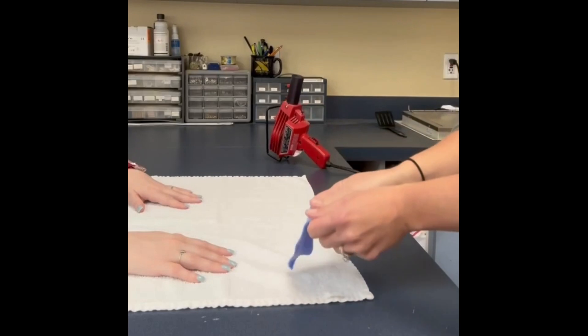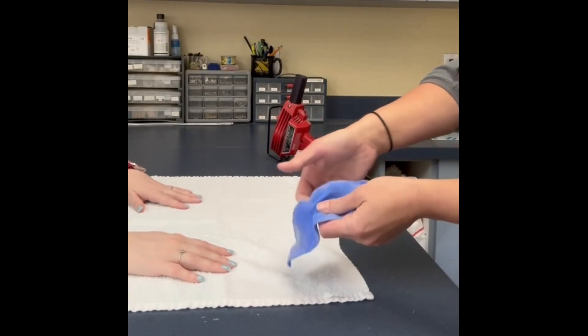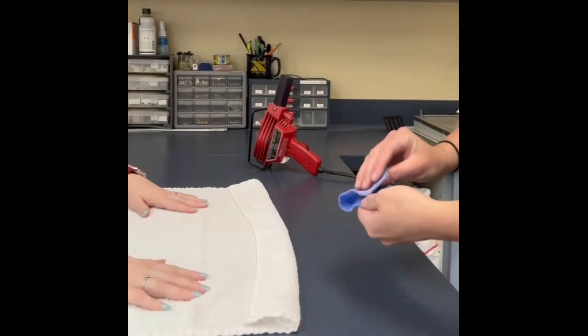Pull the material perpendicular to the fibers and stretch it out, making sure you have a good stretch. The material is very flexible and has good memory.